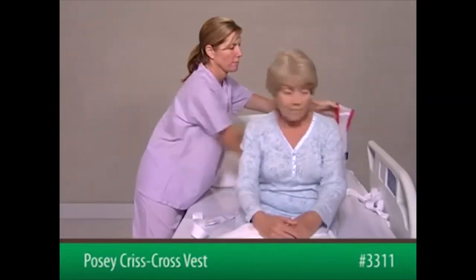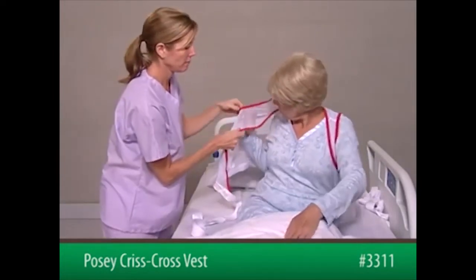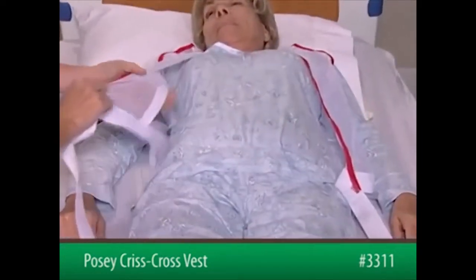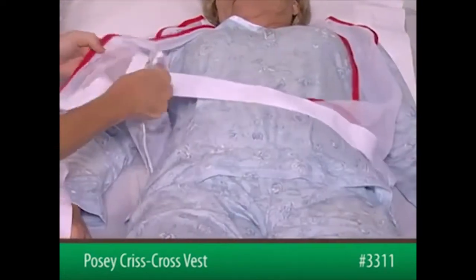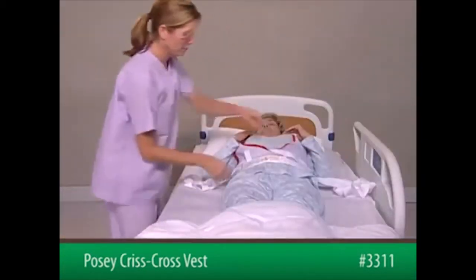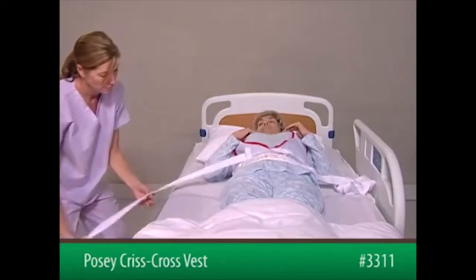To begin, place the device on the patient with the open V-neck in front. Next, position the patient on the bed. Bring both straps in front of the patient and feed the strap from the patient's left side through the slot in the vest on the patient's right side. Secure the straps out of the patient's reach using a quick-release tie.